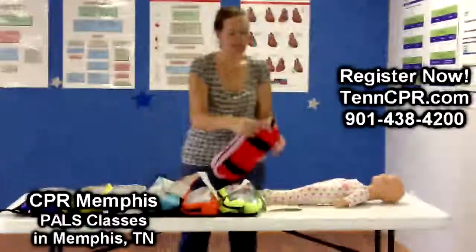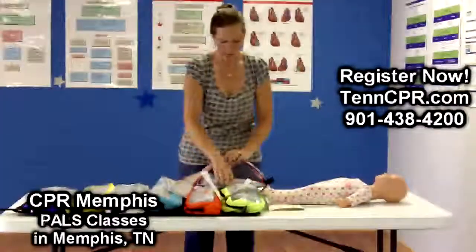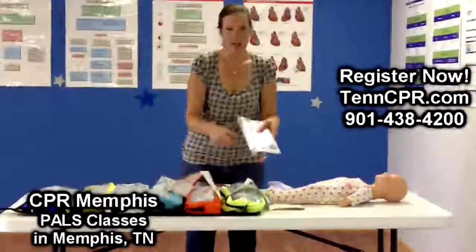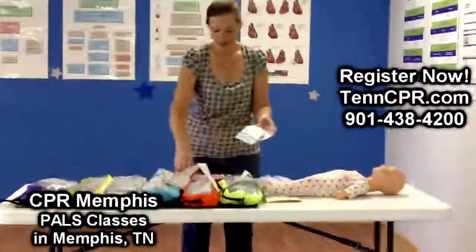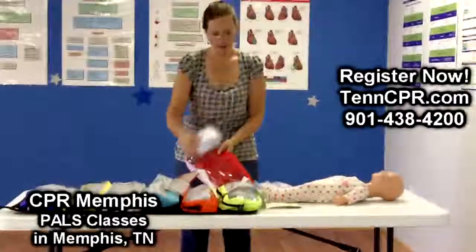In this bag is everything you need in the event that this child is in cardiac arrest. It has ET tube sizes, it has your IO equipment, it has your IV catheters, an IV start kit, as well as other airway adjuncts.